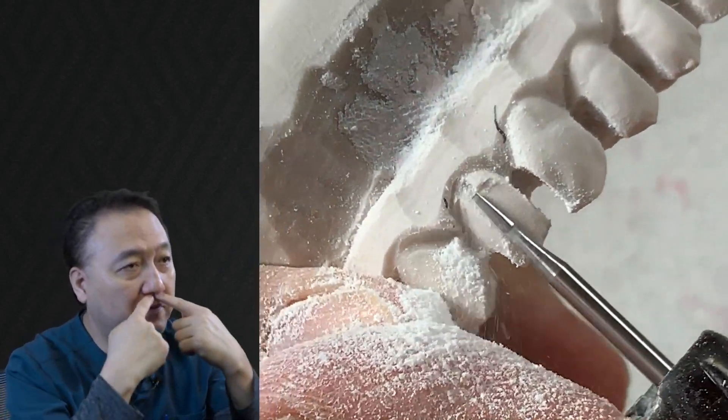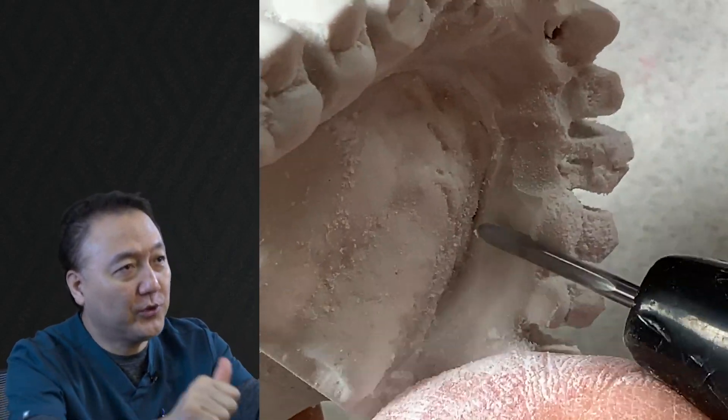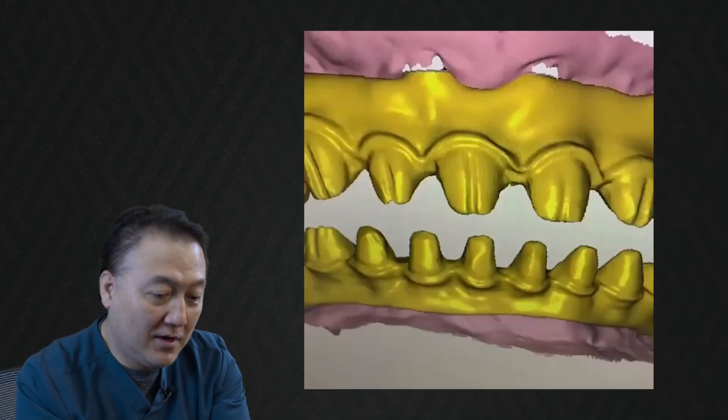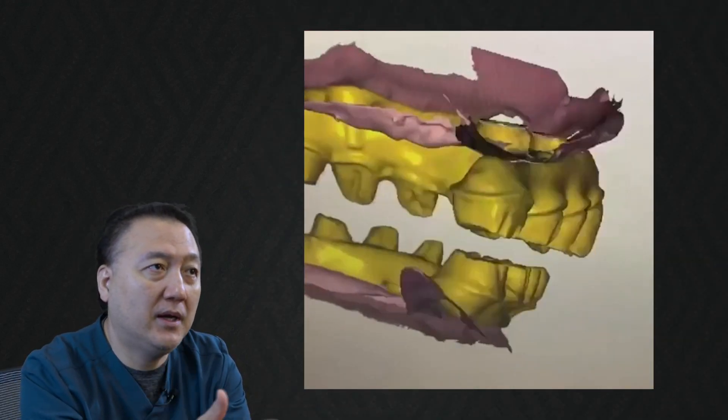I do have limitations on the facial area, but I have the ability on the lingual to bring it in as much as possible. So we copy mill — we design it and then we mill it.